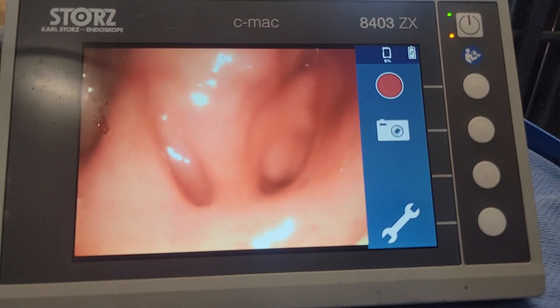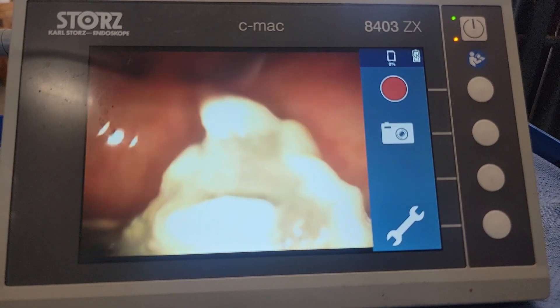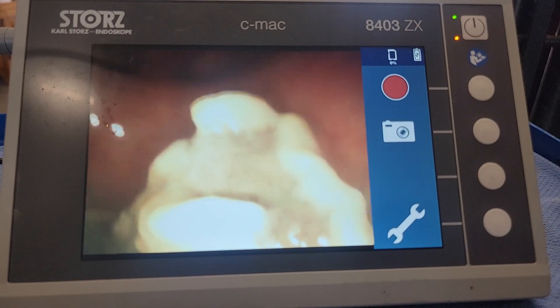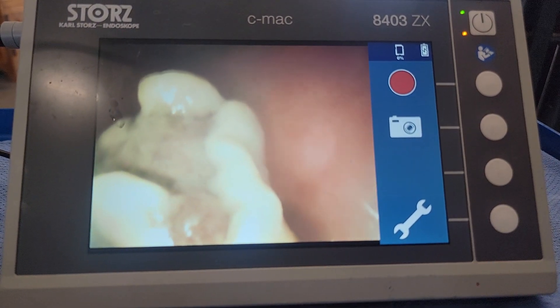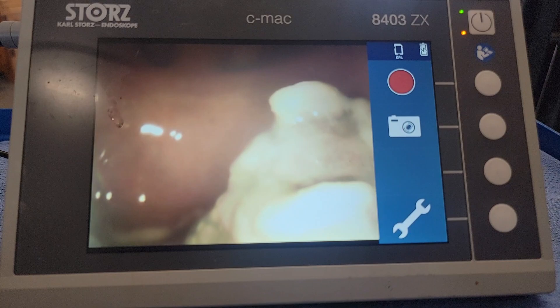You can see all this dried pus here. This is why you don't want to just put horses on antibiotics for treating a sinus infection without actually coming out with the primary diagnosis, because you have to remove the primary problem.